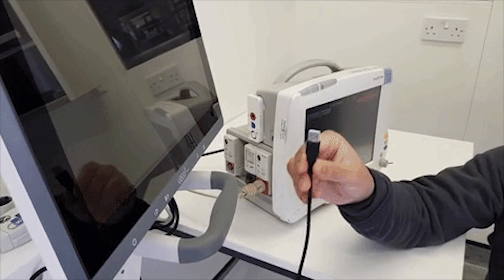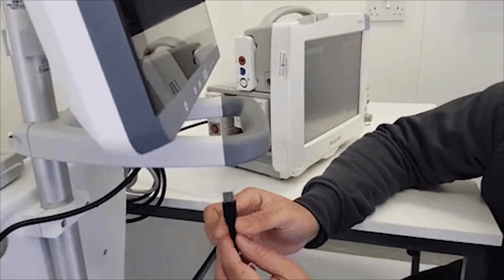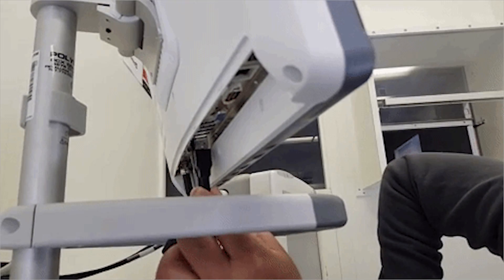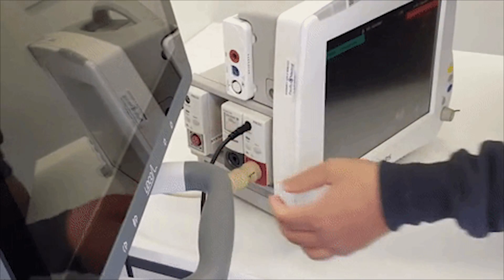Step 2: Connect the Litco to the vital signs monitor. Plug the USB connector into the Litco, then connect to the vital signs monitor's analog output port.